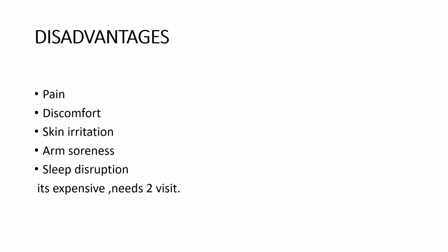I saw the ending part of the discussion on ambulatory blood pressure monitoring. I don't know whether she discussed the findings in terms of dippers, non-dippers, reverse dippers, and the different values.